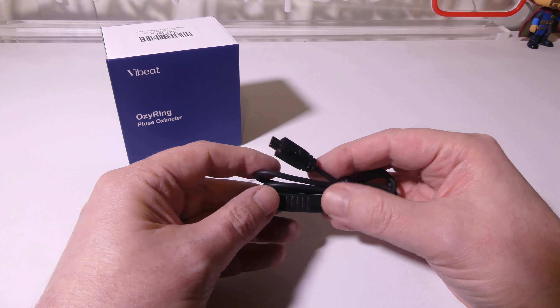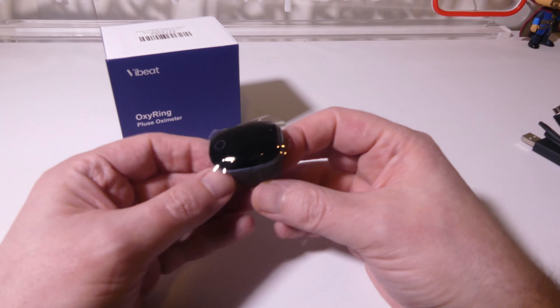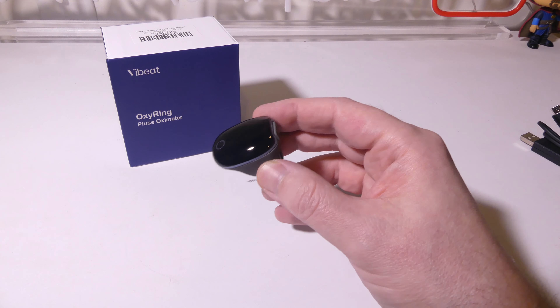You do get a charge cable here and it's a standard USB type A to micro USB, so no USB type C here, but that's okay. I have plenty of micro USB cables and you can plug this end into any laptop or PC USB to charge this up. It takes about two hours to totally charge the unit from zero to a hundred, or you can use something like an AC to USB adapter that you probably have from your phone or tablet.